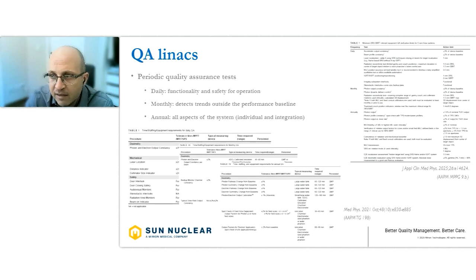The periodic tests that we make in a QA program are necessary to monitor the equipment performance, an important aspect of the quality assurance program. There are excellent publications, many of them reviewed constantly.